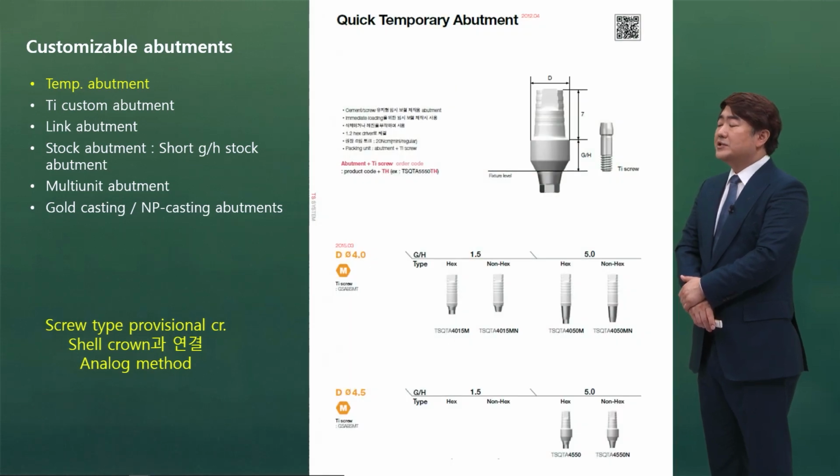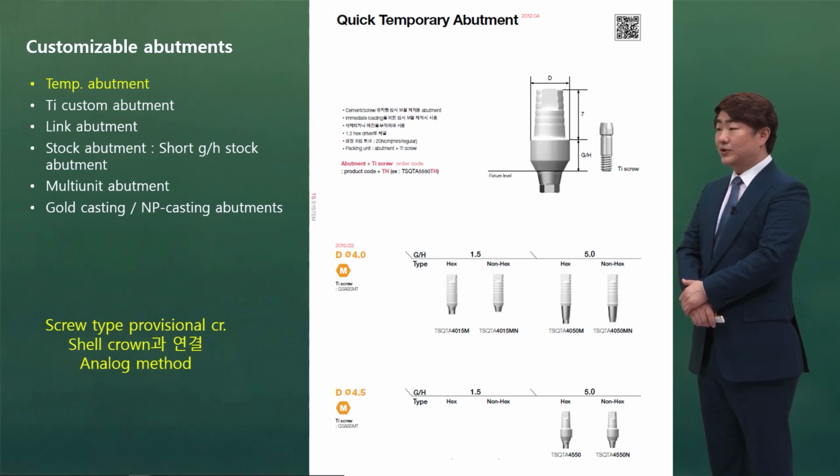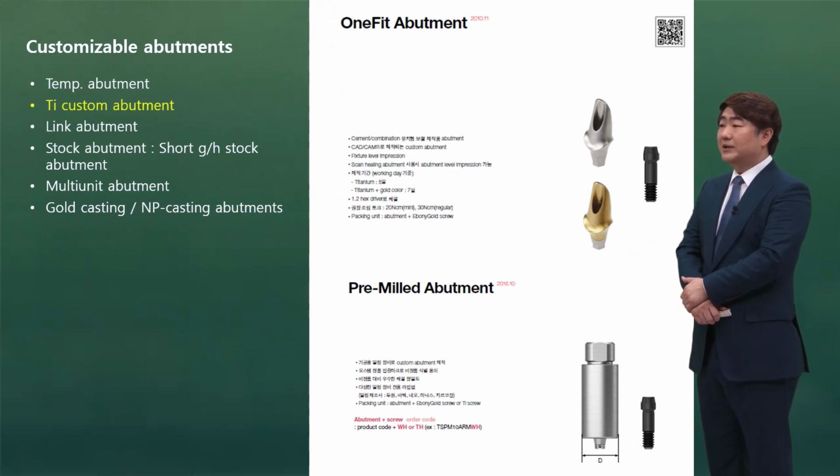Now, if we want more convenient abutment cutting, then plastic can be used. And also, the most popular way in the custom abutment would be this titanium abutment.